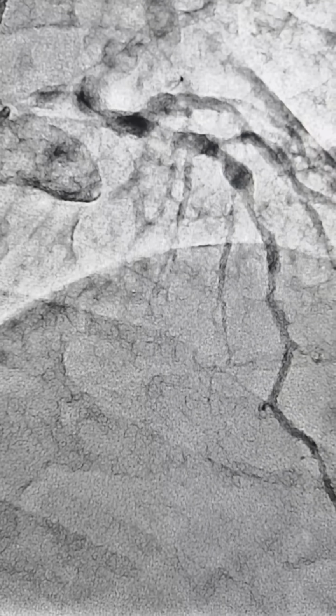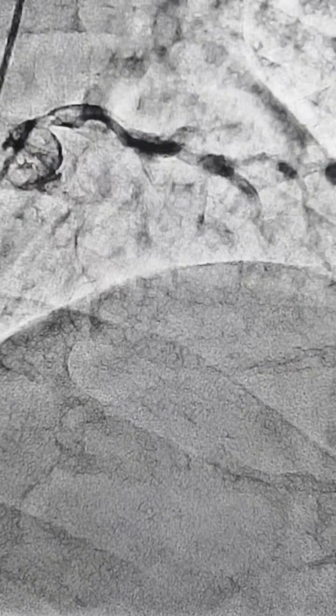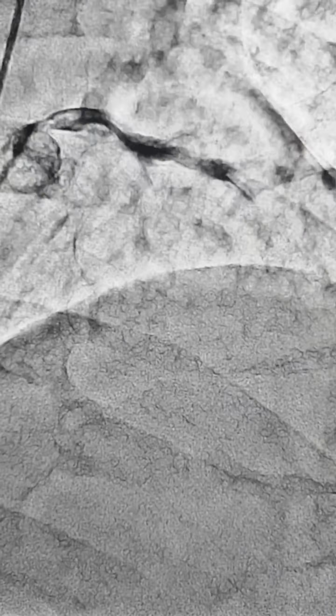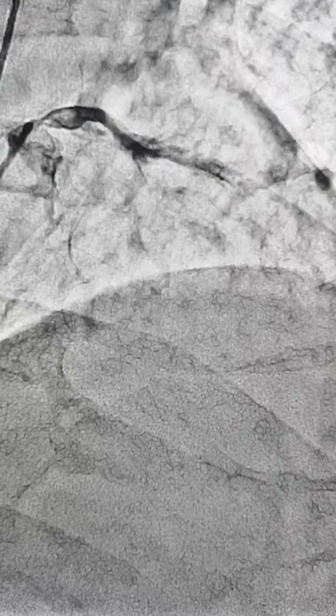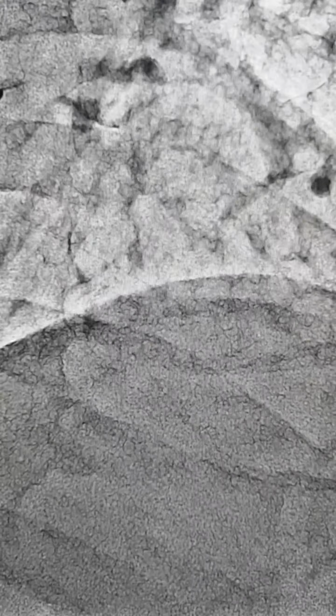Right or wrong, the patient was shifted back, and 10 minutes later he started sweating and had chest pain, and I was called in. He was sweaty, he was quite unwell, and having chest pain, and we got an ECG which showed a broad complex evolving MI, and the patient was going into shock. So this is the ECG, we'll just show you the ECG, and that's how it looked about 10 minutes later.